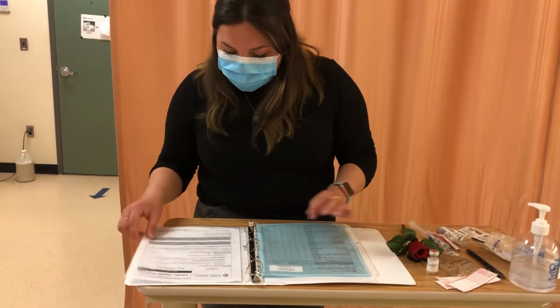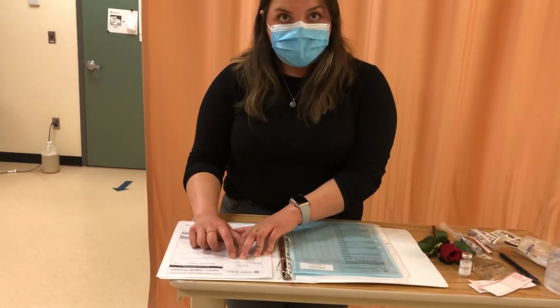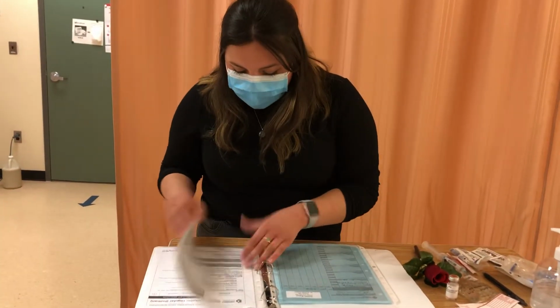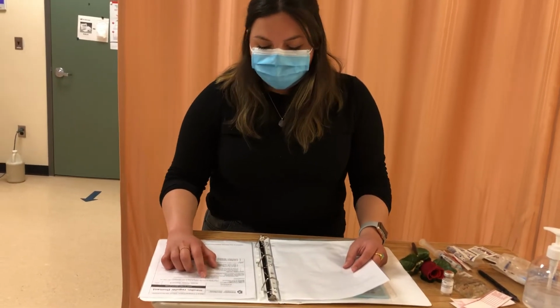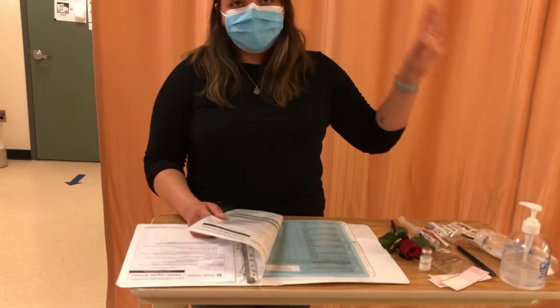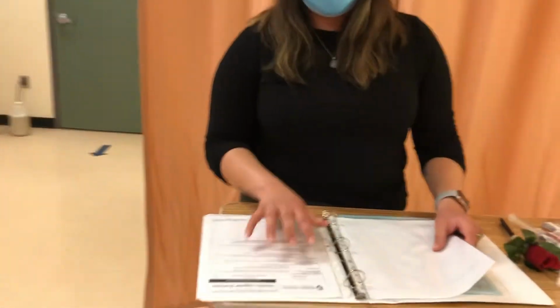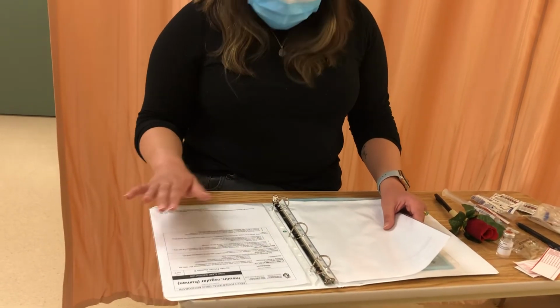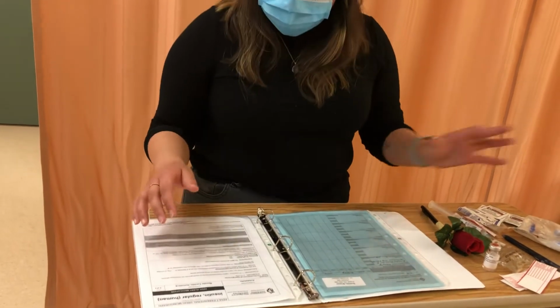It's still Insulin R. The regular dosing for an IV continuous is 1 to 10 units an hour. We have 2 units an hour ordered, so we're okay with that. And then I'm going to check the compatibility. The compatibility states that this drug is compatible with normal saline. That is what we have for reconstituting, and that was what was ordered for a TKVO. So compatibility is good. Some potential hazards for this drug are hypoglycemia. So I'm going to be assessing my patient for that and ensuring that he is okay. And then I know what to do if he does have a reaction.